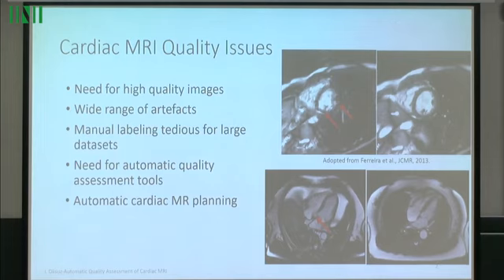Manually figuring out and classifying these error cases one by one is a tedious task. So there is a need for automatic quality assessment tools. And with the successful deployment of such tools, automatic cardiac MR planning can be achieved.